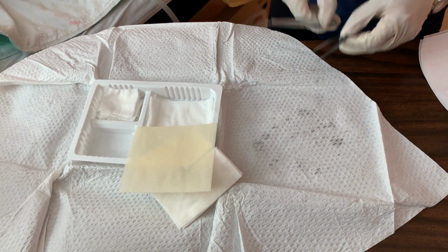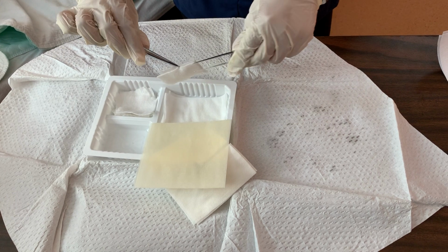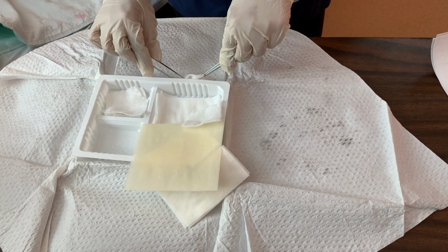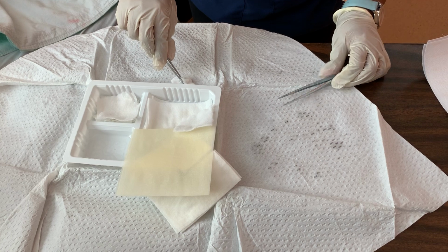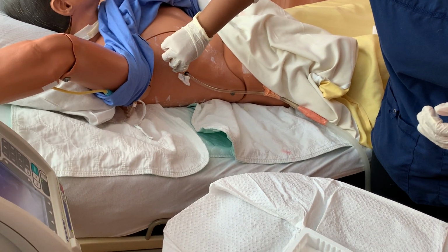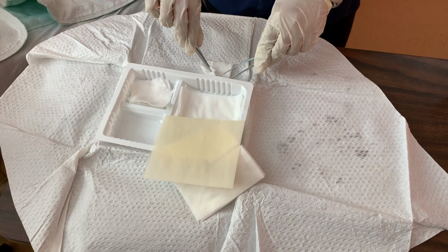I'm just gonna take my forceps. I'm just gonna go right here. It's still sterile. It's within my 1 inches for sure. Dip it in, and I'm gonna start right at the, or closest to, the insertion site. Go around, pull that out. 1 swipe per wipe.